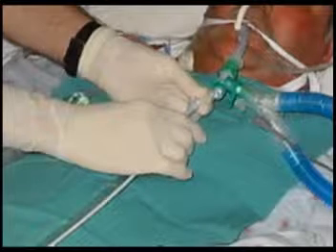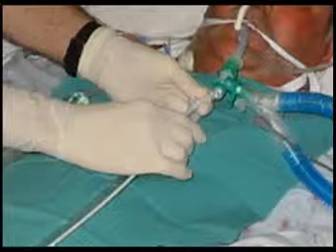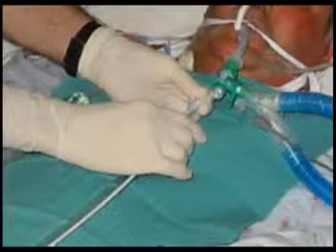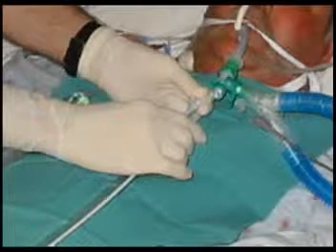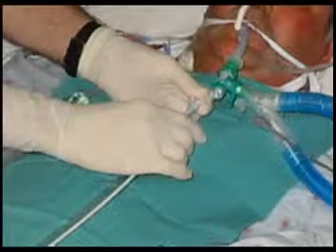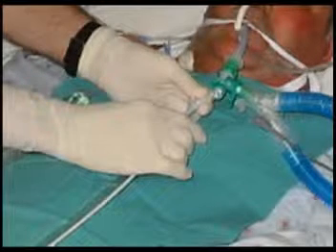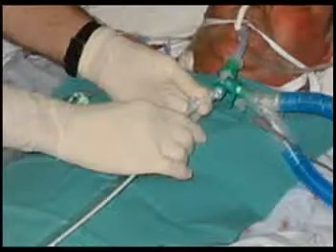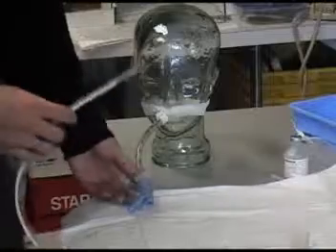However, I'd like to mention there are many institutions throughout the U.S. that are doing this on fully awake patients, and there are many others who are increasing the sedation on their patients when they do this. At the University of Maryland, it's written into the protocol that you can go ahead and increase the sedation, therefore making it a little bit more comfortable for the patient. Obviously, what we're doing here is we're going down into the lower lung, which patients obviously aren't used to. So by increasing the sedation, it should lessen the cough response and also allow the patient to have a higher comfort level. Now we're ready to insert the Combicath.